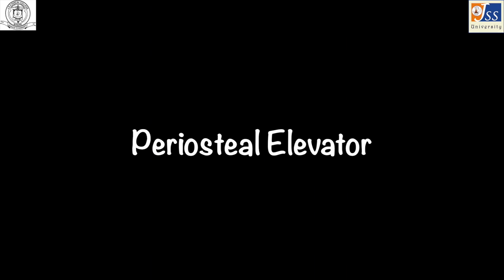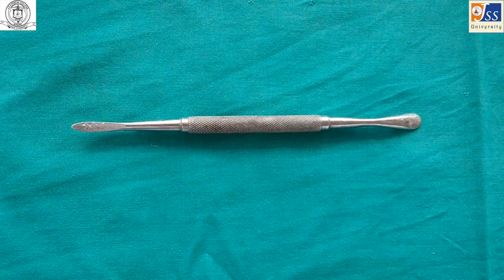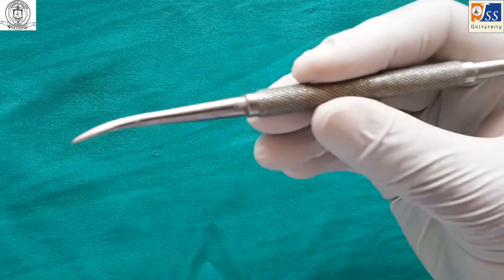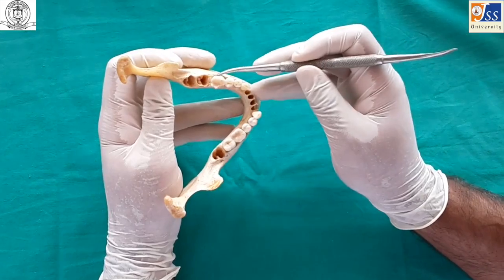The periosteal elevator is used for separating mucoperiosteum from the tooth. It is held in a modified pen grasp and is usually used in a push, pull, or pry motion.